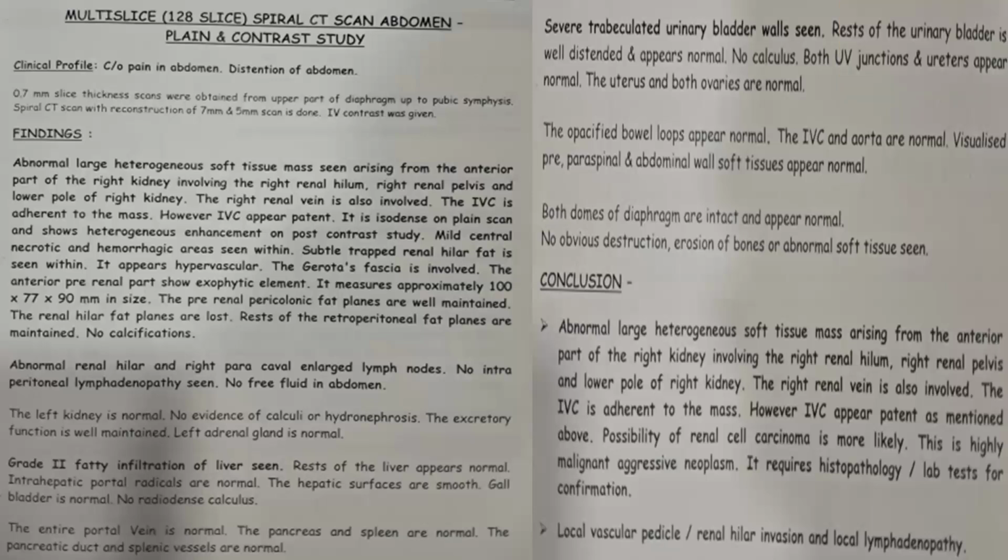Correct. Fine. Just for the practical aspect, many times the mass is only pressing the renal vein, and it appears that the renal vein is involved by the mass. That can also happen, for the practical part.